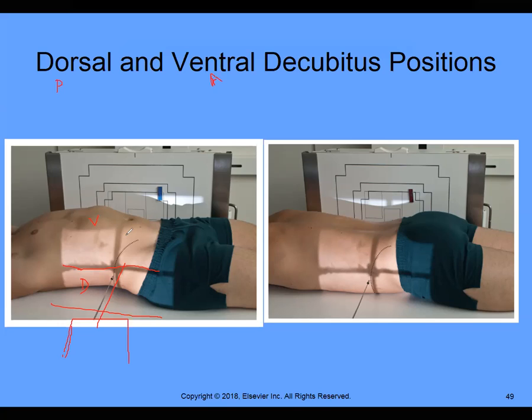And because his left side is closest to the image receptor, we say that this is a left dorsal decubitus.